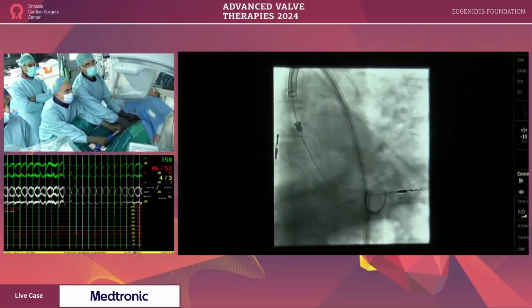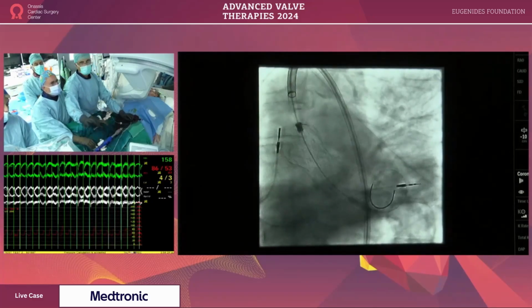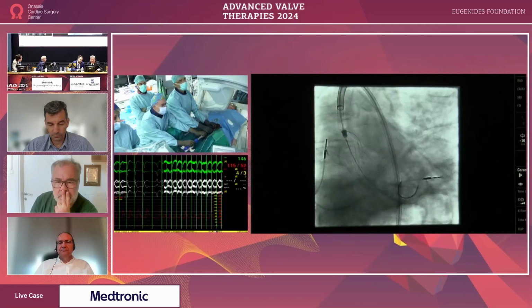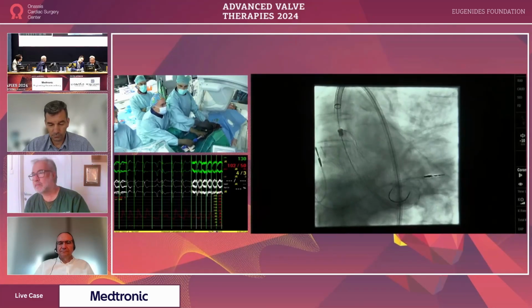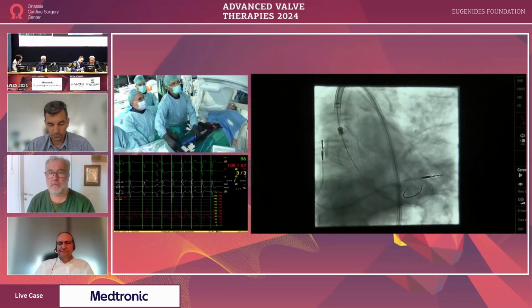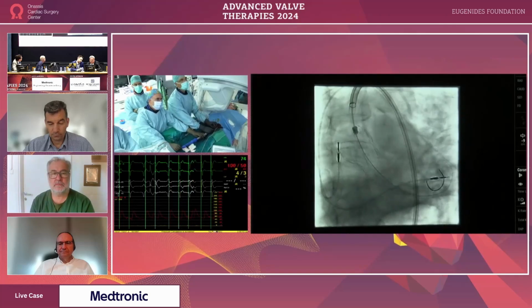Looks like you connected a little bit, no? One pole is connected, no? One pole is connected. Yes, we know. Very careful. We have to, no, hold on a second, Vasily. We have to place. I think you released it. You pushed a little bit and it released.